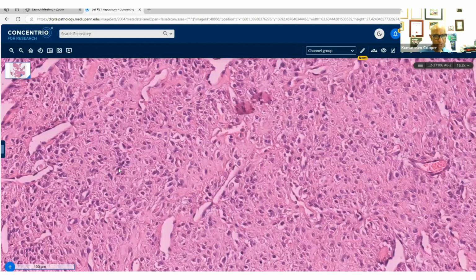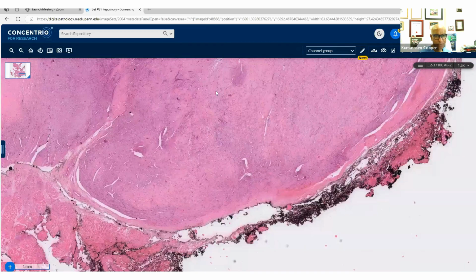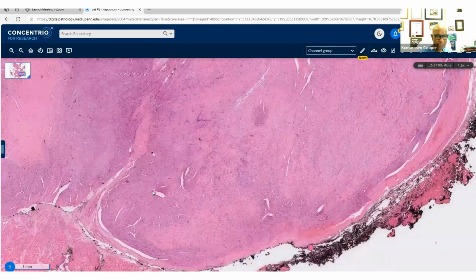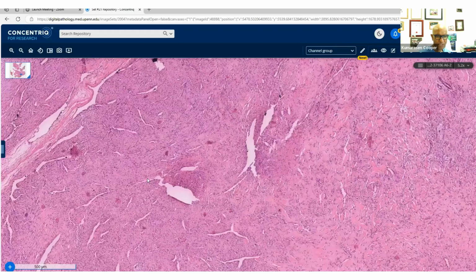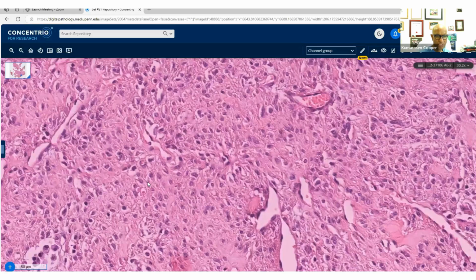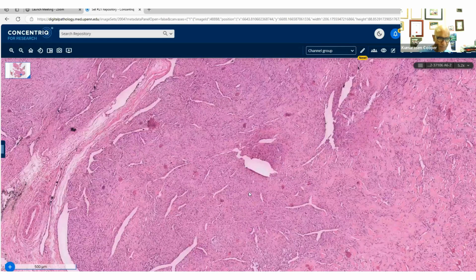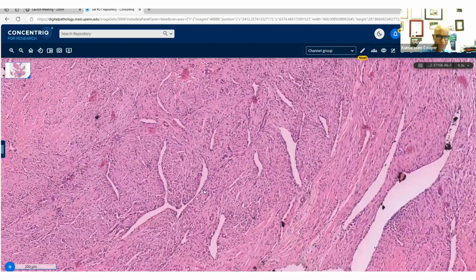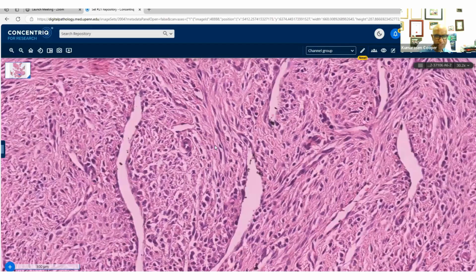And that's pretty much the nodule that we're talking about, these multinodular areas that are hypocellular with a lot of fibrosis, and other areas that are still cellular, like you see here, with this rich vascular pattern. That probably is the same picture we'll see in all the nodules. Here, if we look at the periphery of this nodule, you can appreciate more spindling of these cells.